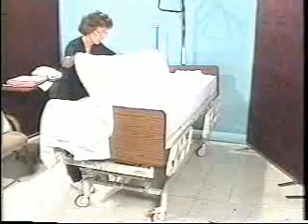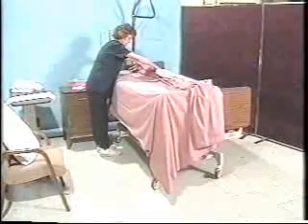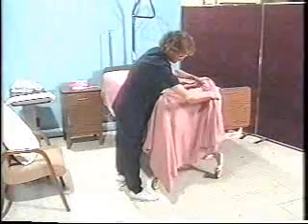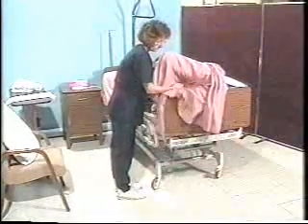And the upper end is 6 to 8 inches from the top of the mattress. Then she folds the extra material to the center. The bedspread's next. The upper end is placed so it is even with the top of the mattress. She makes sure that the linen facing the door will be covered by the bedspread so the bed has a neat appearance. She tucks in the top sheet, blanket and bedspread at the foot of the bed.